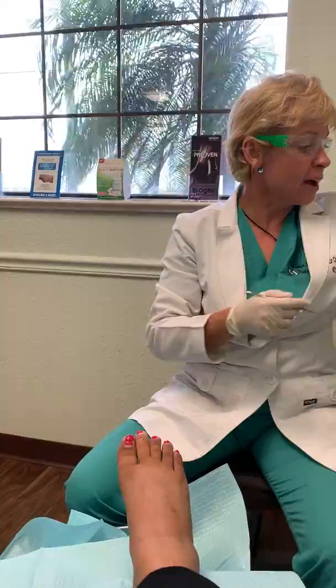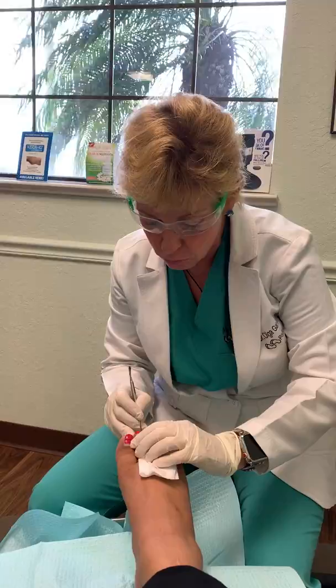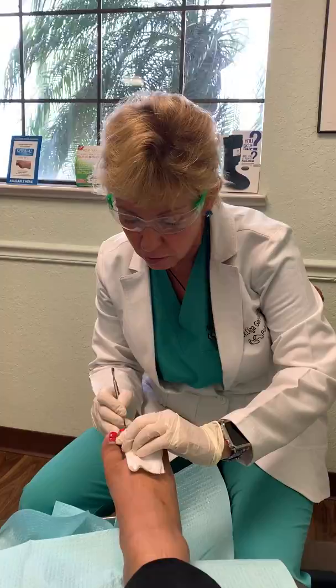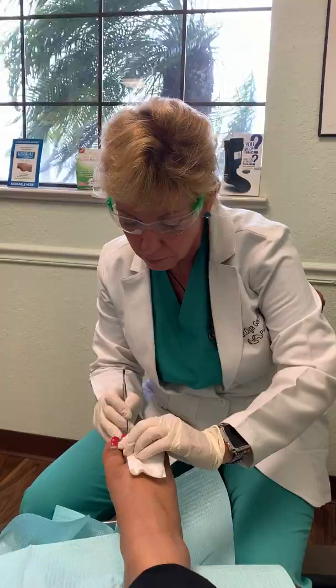Because we have a chronic ingrown toenail here, we are going to try to preserve as much of the nail as possible — because ladies like to wear pretty shoes and sandals and have nail polish — so I want to take off as little as possible from the corner to maintain as much of the nail plate as possible. So I'm just freeing up the nail edge.